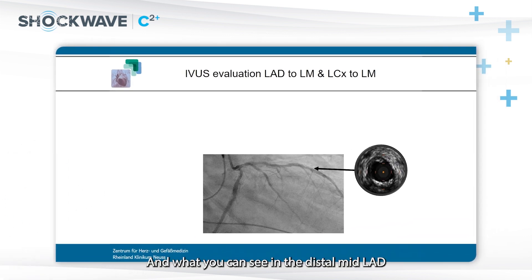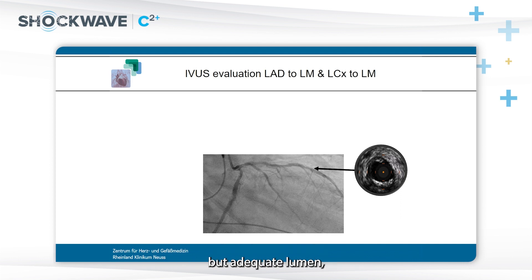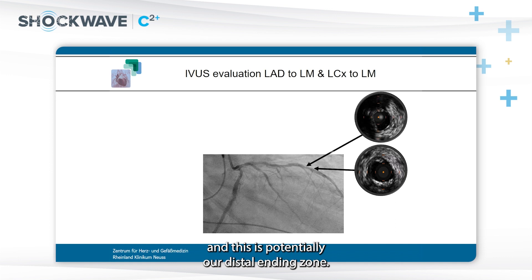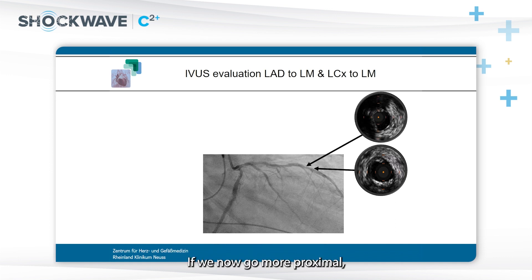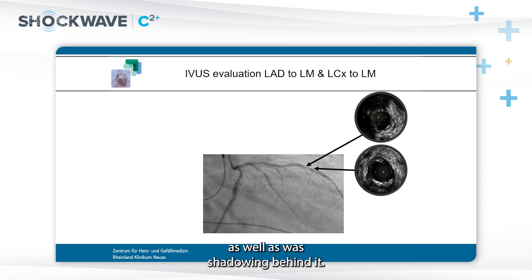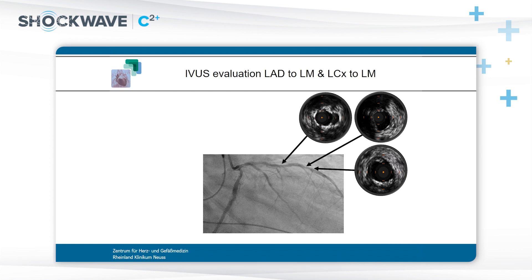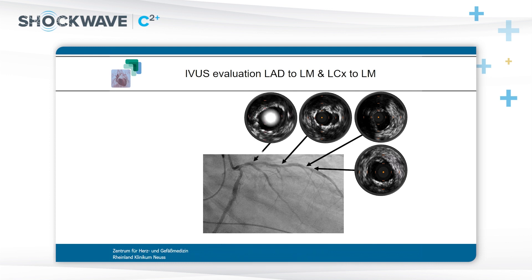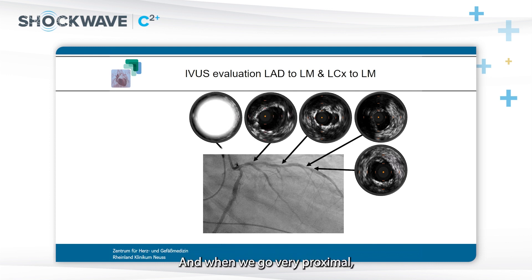In the distal mid LAD, there is some disease with a little spot of calcium at 6 o'clock, but adequate lumen — this is potentially our distal landing zone. Going more proximal, the stenosis builds up and calcium becomes visible both as white color on IVUS and with shadowing behind it, becoming more circumferential, reaching full circumference of the artery.